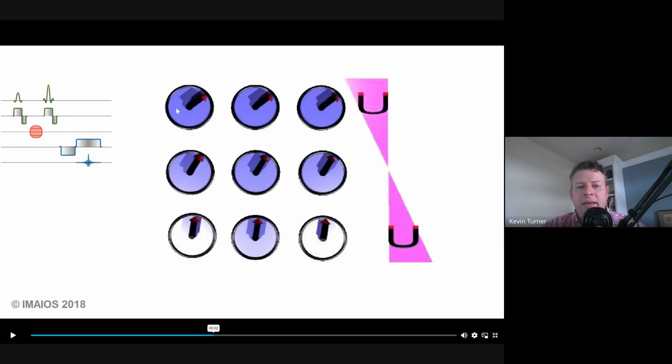Now, when the computer reads the image, it knows that any of the protons at here on the patient was in the top part of the patient. So these protons have to go at the top of the image. These protons were in the middle of the patient, so they have to go to the middle of the image. And these protons were down here, so they have to go to the bottom of the image. So by altering the phase of the protons, that will change the echo. The different phase of these protons will create different codes inside of the echo, encoding. Let's take a look at that real quick.